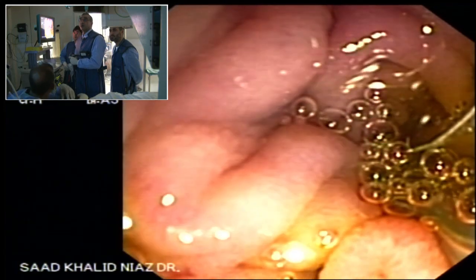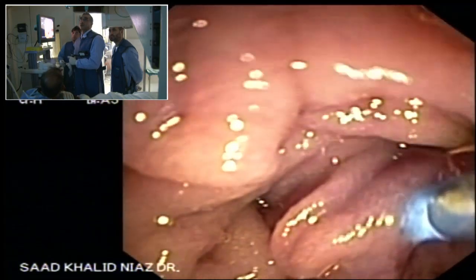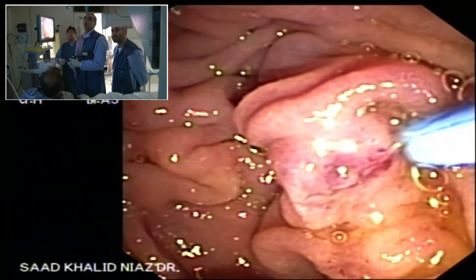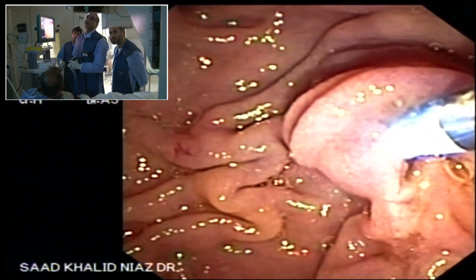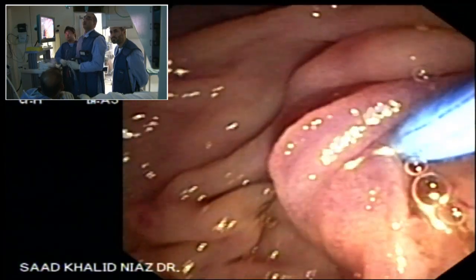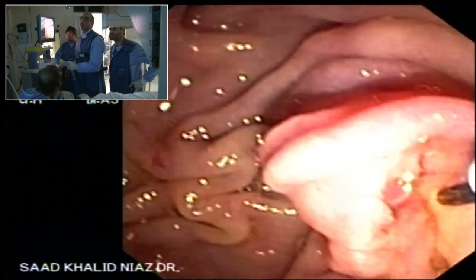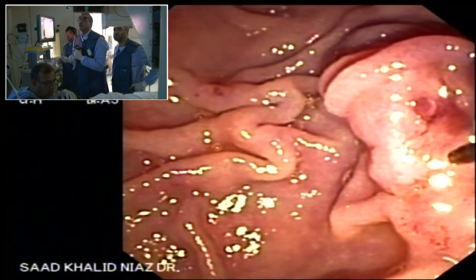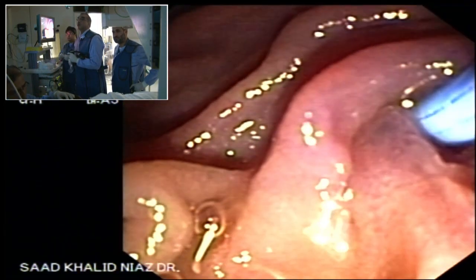कोई एट्रोपिन. हाँ हाँ, ट्राई करें. यार नो नो. नहीं, it's in the wrong spot. वायर एडवांस करें. So here you really need to disturb this thing so that it. हाँ नो. ठीक है. इधर करें.